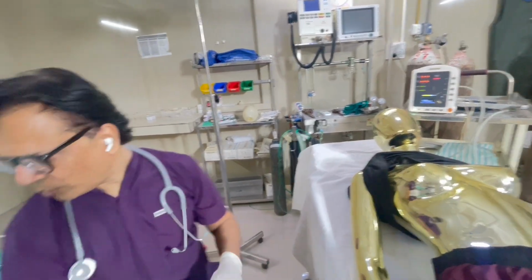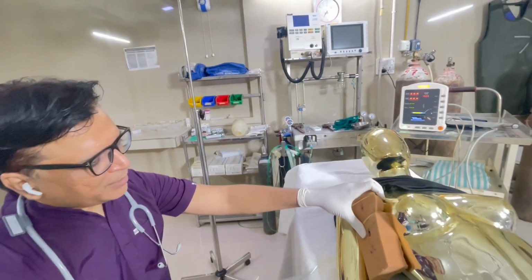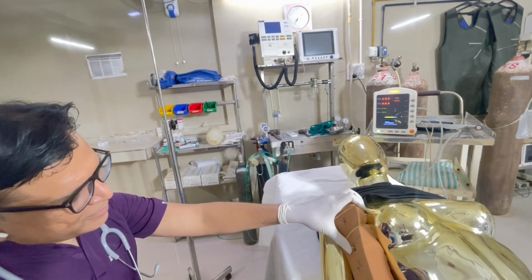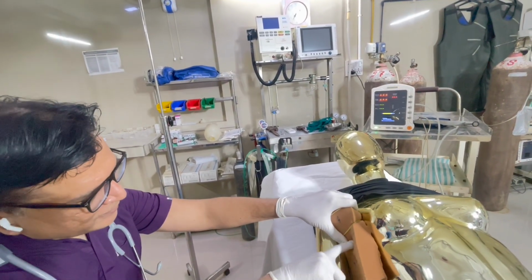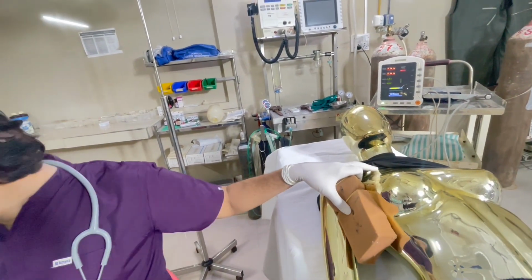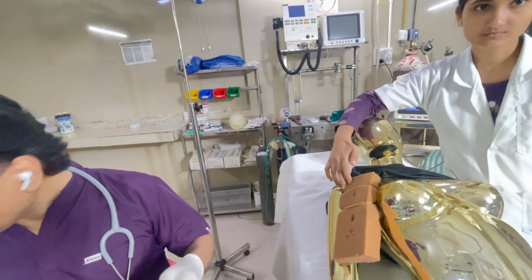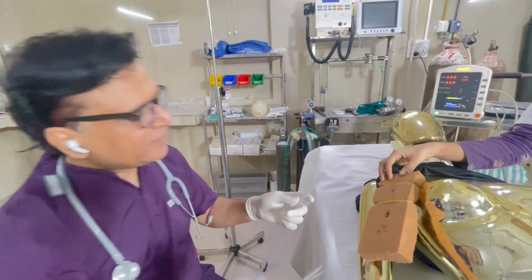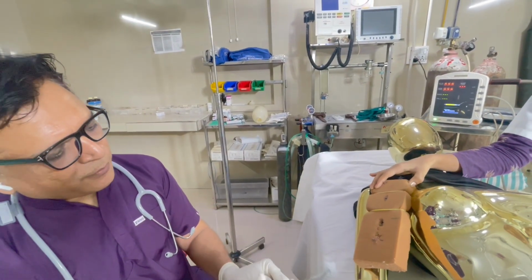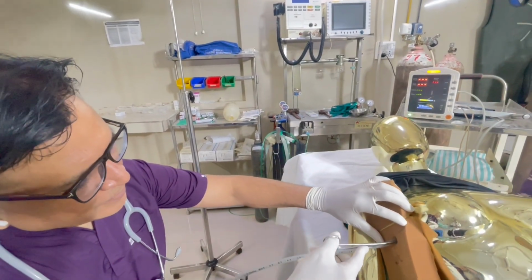Once you go in this manner, for example, you put this like this, then you make a swiping movement with a finger, and then you try to hold and put a drain in such a manner that the drain has to be held in this manner with the artery forceps, and it has to be pierced inside.